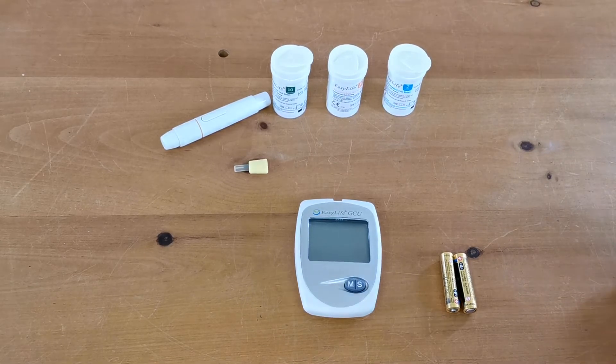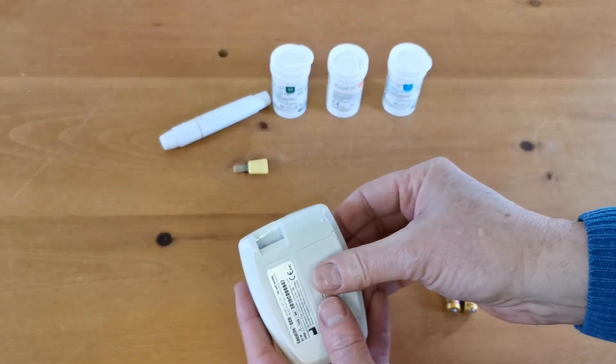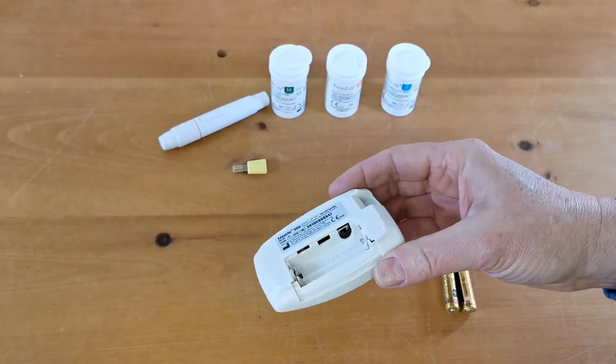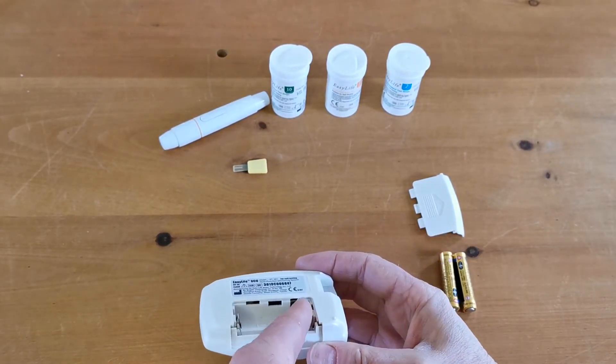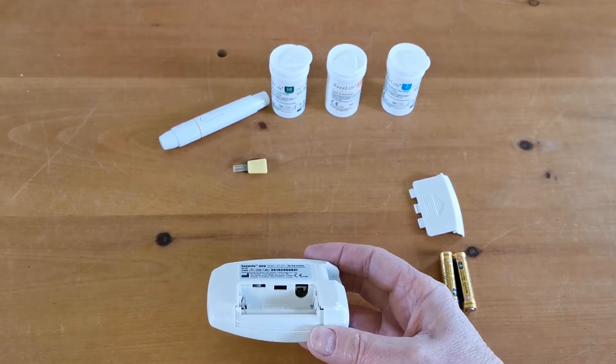When you first get the meter it comes without the batteries inserted. To insert the batteries you open this port on the rear of the unit — it comes away quite nicely. Just before we put the batteries in, I'm going to show you this little switch down here because it's quite key in terms of what readings you're going to get the meter to display.